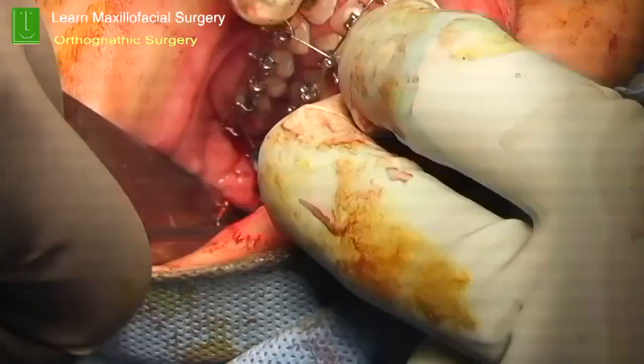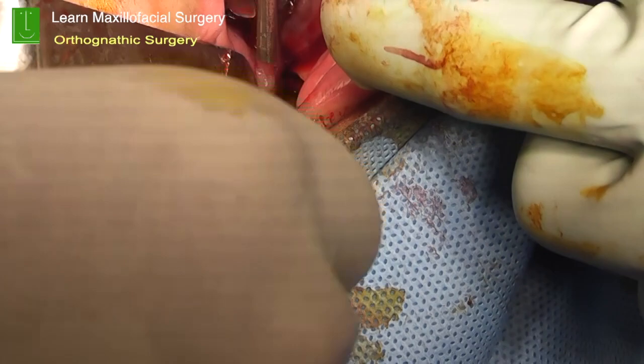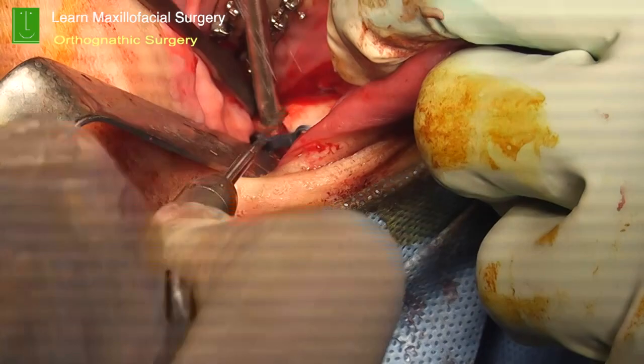And then you use a titanium plate. You can see a four-hole titanium plate which is being used to fix the osteotomy fragments. A 2x6 or 2x8 millimeter screw is generally used. 2 mm, you have to have a good enough amount of rigidity. Some people use even a reconstruction plate, but I personally like to use a simple 2 mm mini plate, which is rigid enough and gives good approximation of the fragment.